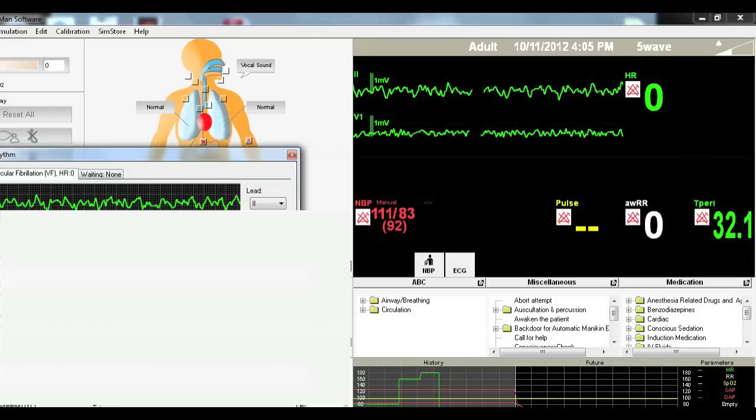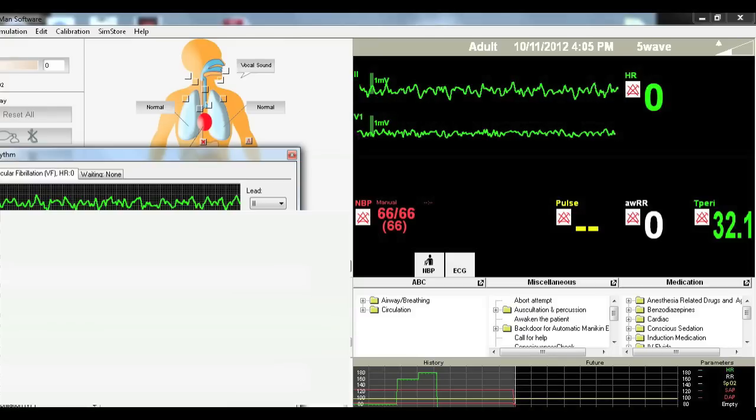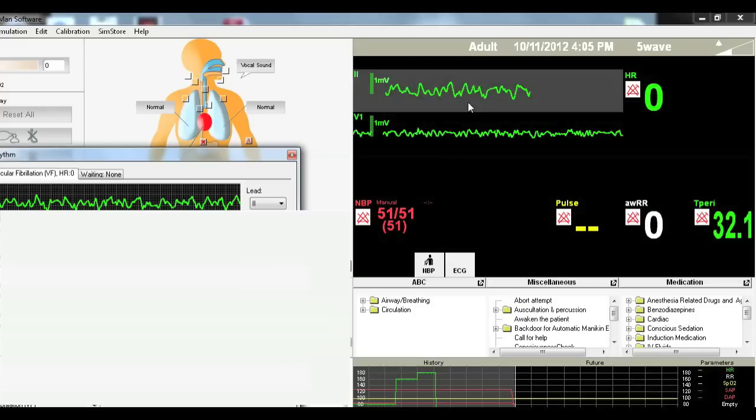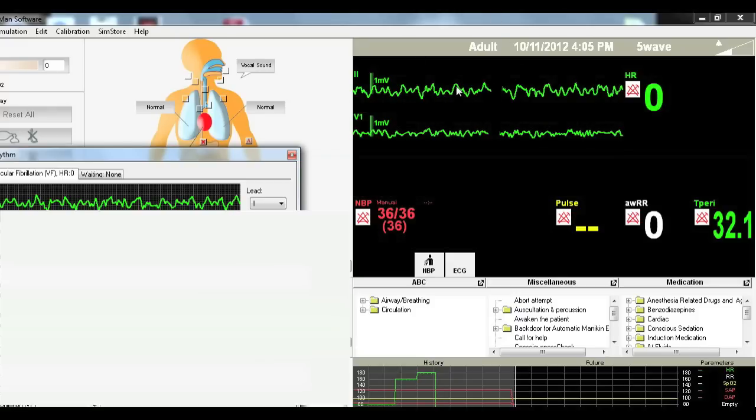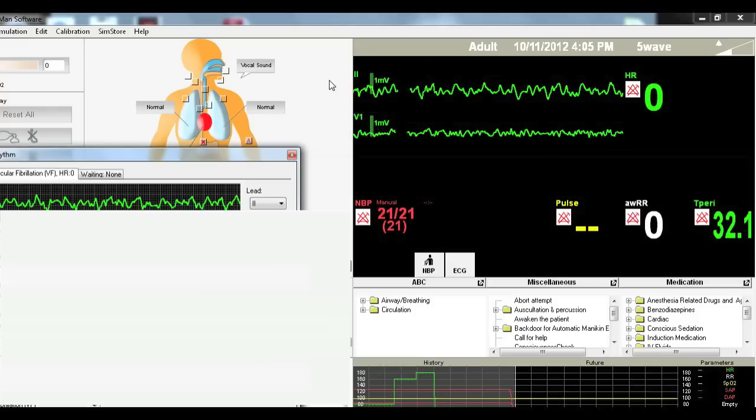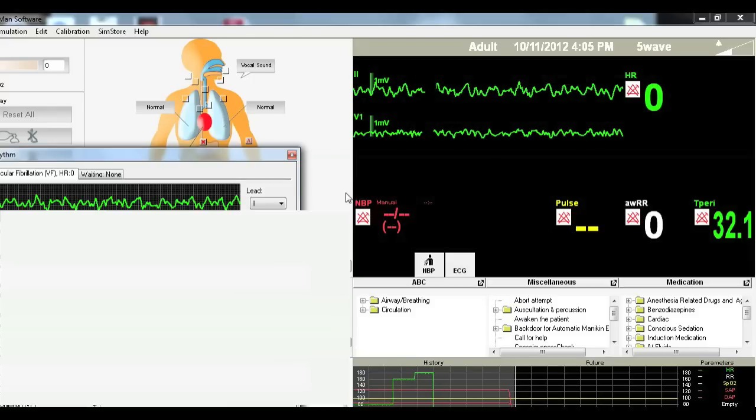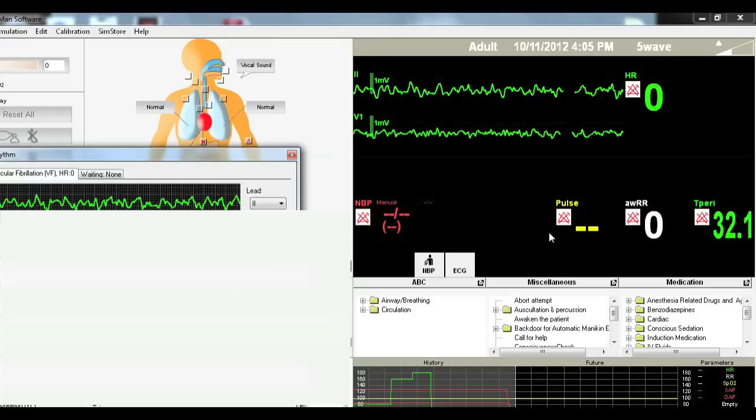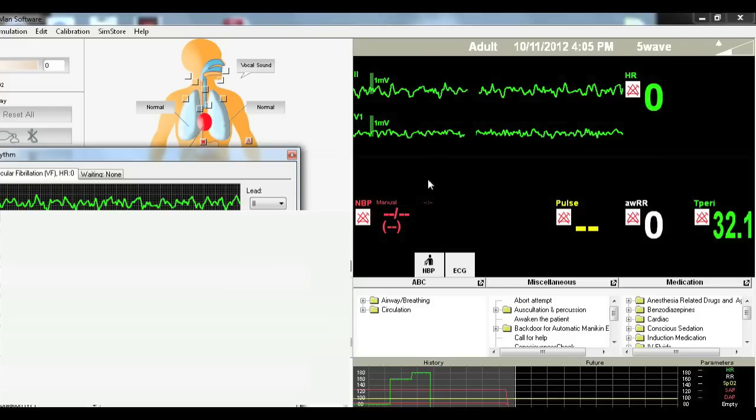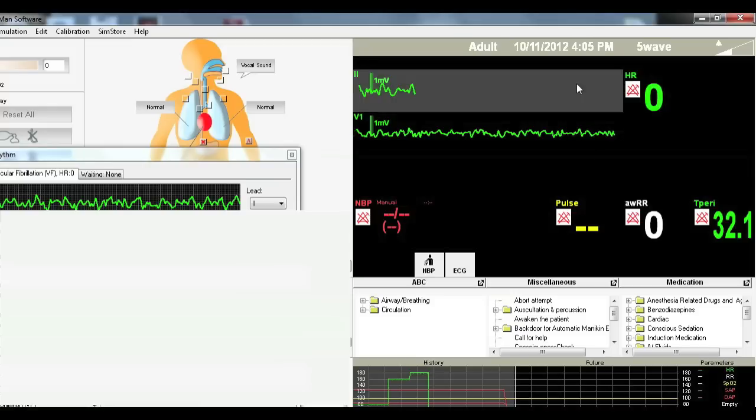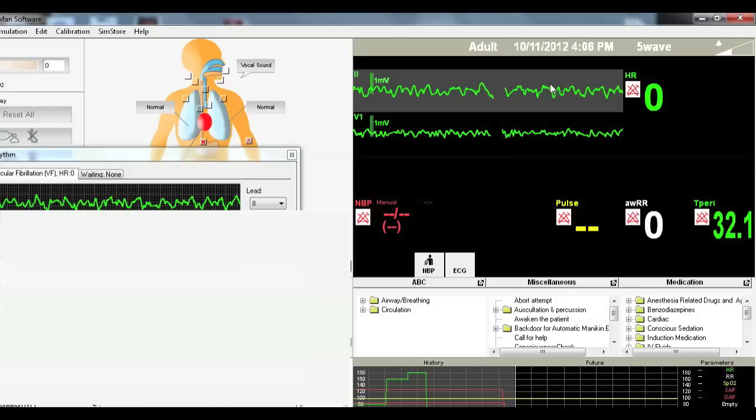What do you think this rhythm is? This is V-fib, ventricular fibrillation. There is absolutely no recognizable or oriented electrical rhythm. This is just random electrical activity. The heart will be looking like a bag of worms if you were to see it. You have no recognizable pulse seen up here. So random electrical activity. There are no QRS waves, no P waves, no T waves, nothing. It's just random. This is life-threatening. This will kill you. You don't have a pulse. You need to give them pharmacological treatment and defibrillate them.